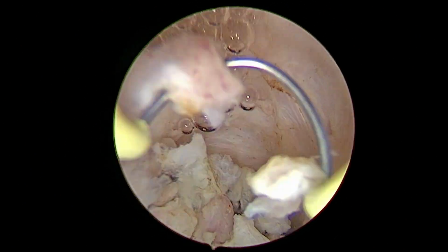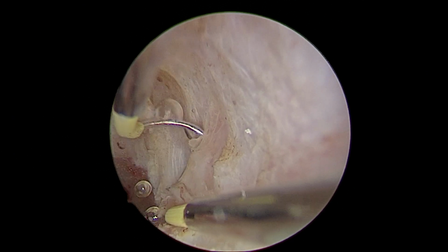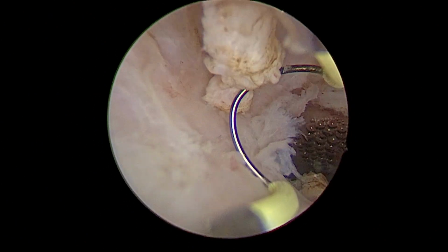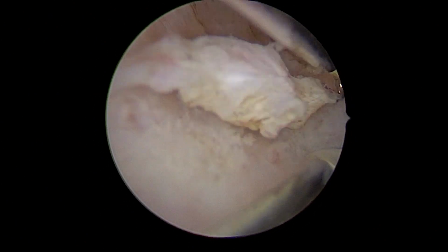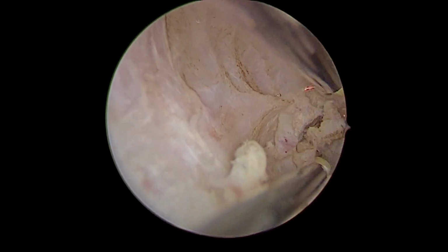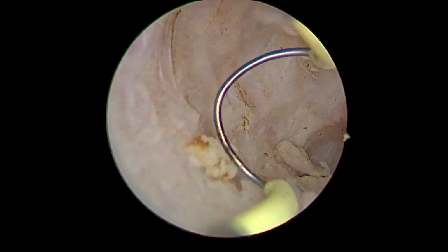But here in this case, because the residual myometrial thickness is quite good, which is 6 millimeter, and the size of the isthmocele was almost 50% of the thickness, that's why we opted for this route of isthmocele correction by hysteroscopy. In studies, it has been shown to have similar success rate compared to laparoscopy if residual myometrial thickness is more than 3 millimeter. Symptom wise, pregnancy wise, the results are the same.